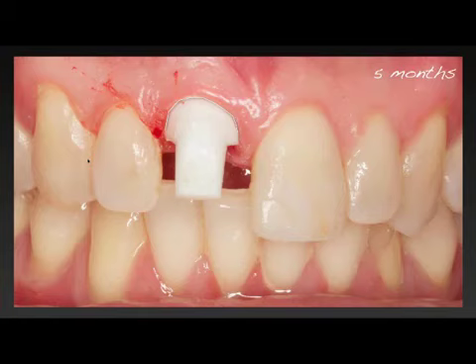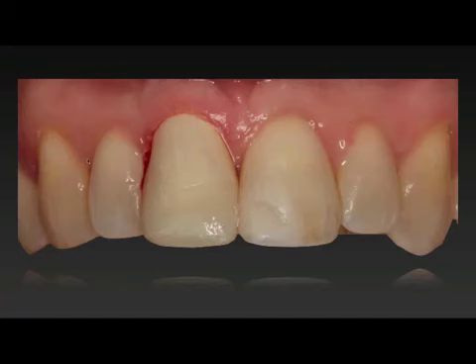So we prepared that, took an impression, and we're going to fabricate a temporary restoration. And this sat with the temporary restoration for a long time. It's yet to be restored, but we have a lot of stability with that facial tissue.